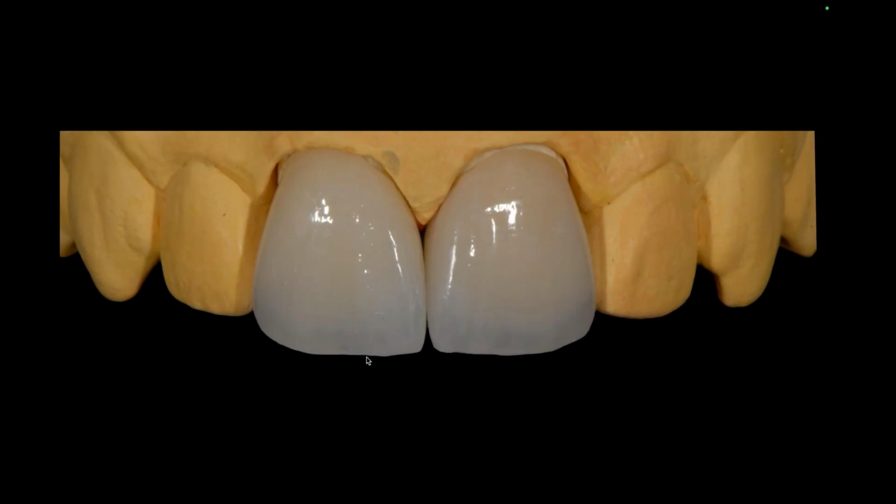Now, when you look at those teeth, some of you probably look at it and say, oh, I like the more translucent one. You might, but I'm going to tell you that's not going to look half as good in the mouth. I want density. I want some of this density in the mouth. Now, these aren't a real case. I didn't put it in the mouth, but I'm going to show you why we're wrong by not using those secondary materials.